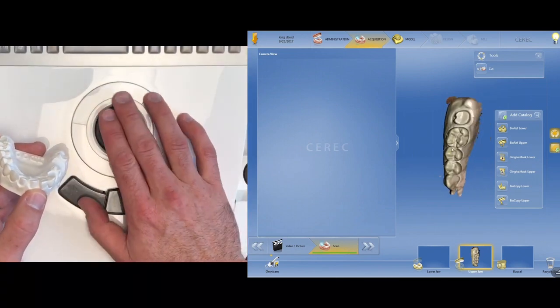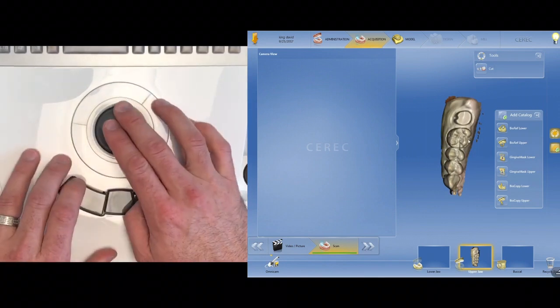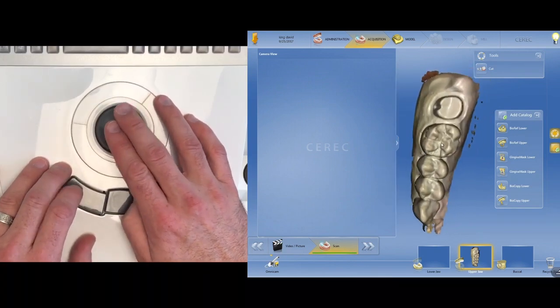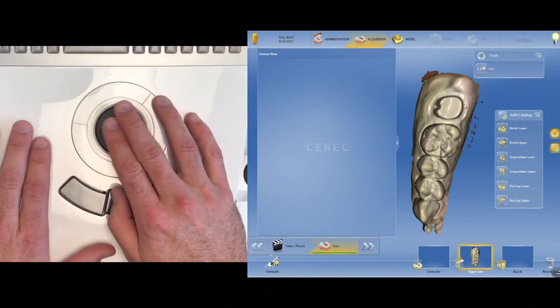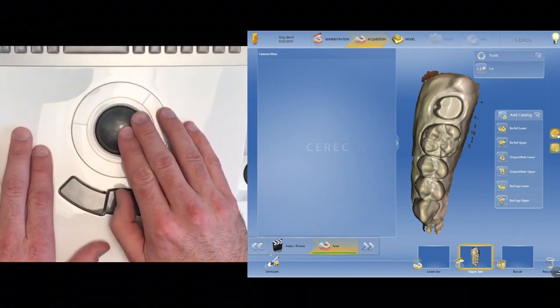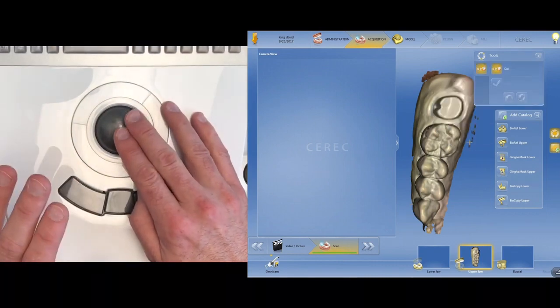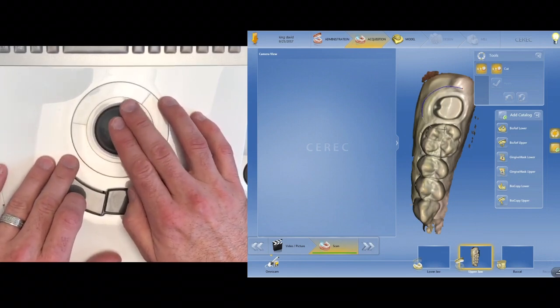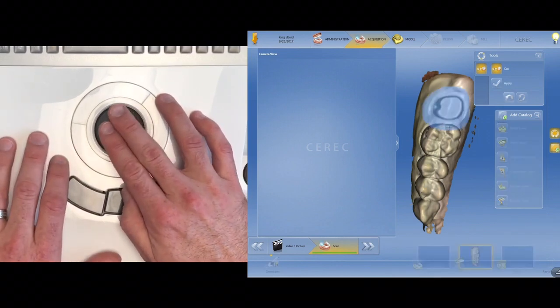Okay, so let's say I'm an assistant getting ready for the doctor to come in the room. I want to do all the imaging I can to help make the process a little faster. So I would image the upper arch, and then I would cut out the tooth, this tooth right here that we were going to prepare if we had not prepped it yet. So I'm going to turn on my cut tool, which again is up here. Or I can right click, turn on the cut tool, and I can cut out that tooth that we're going to be preparing. And I would always include just a little bit of the adjacent tooth so we get a fresh image of the contact point.